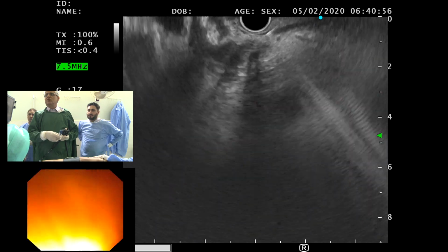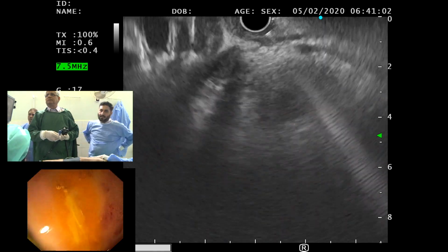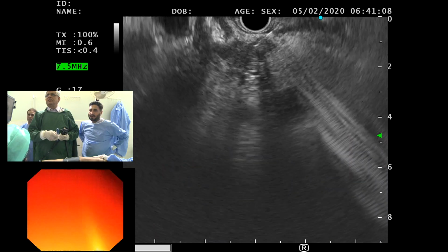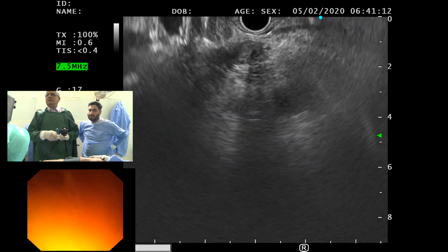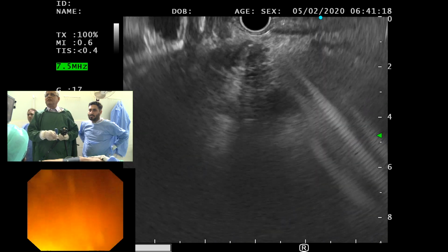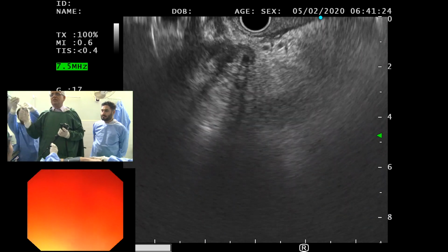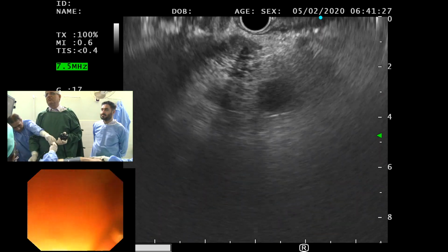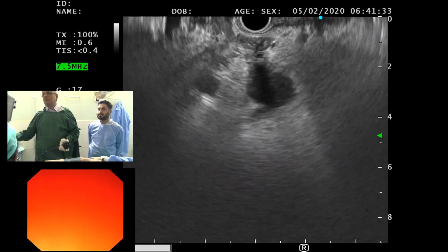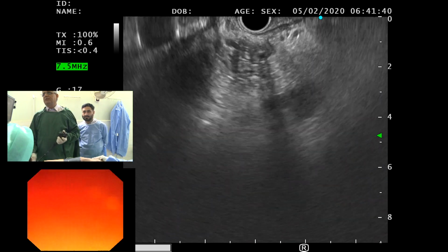My experience is the yield is about 30-40%. You have the option of intraductal biopsies, you can do it, yes. But I can feel that I'm getting some tissue here just by the feel of it. So I'm hoping that we'll get something out of it. The yield is actually, with ROSE, pretty good. We will be able to find out what we've got, and then obviously accordingly see how many passes we have to make.